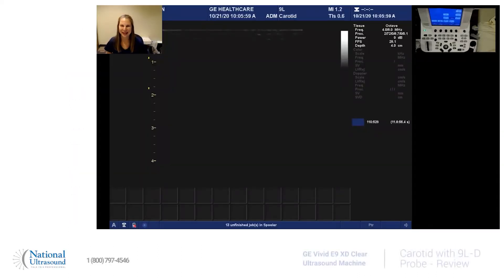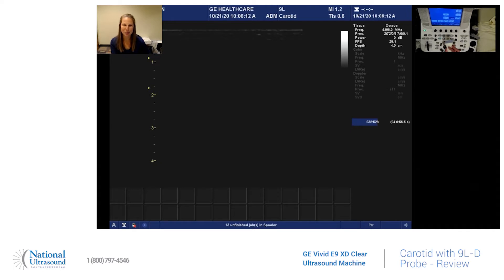Hi, my name is Jackie Klebeck. I've been a registered vascular, cardiac, and general sonographer for eight years. I'm here at National Ultrasound on a Vivid E9 using a 9LD probe, and today I'm going to show you how to use the color pulse wave and measurement functions while we're in the carotid preset.